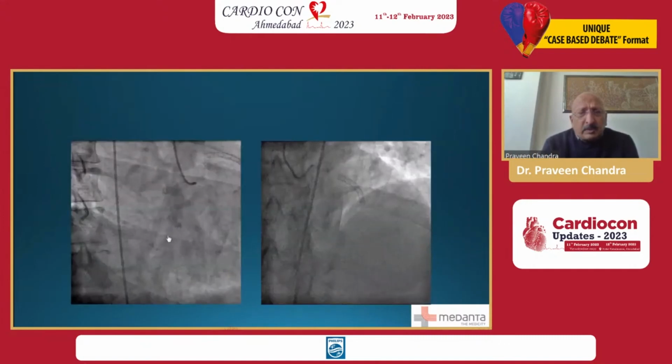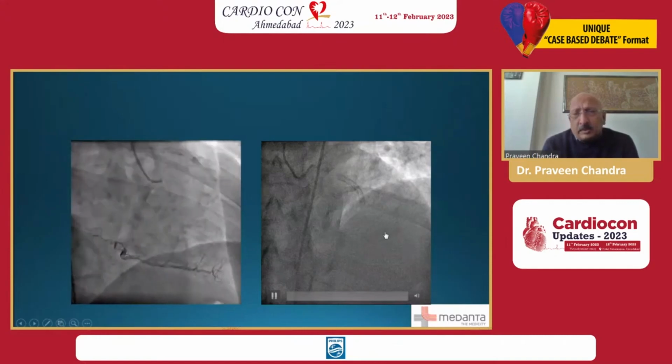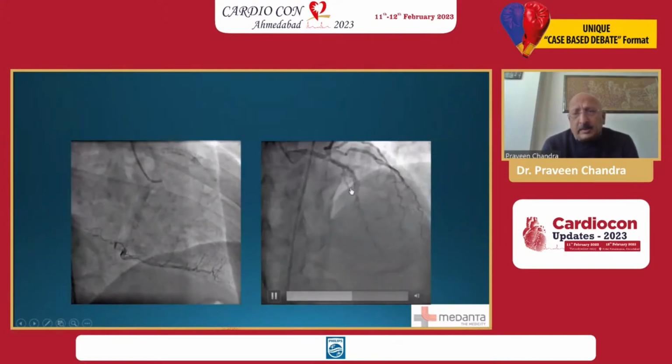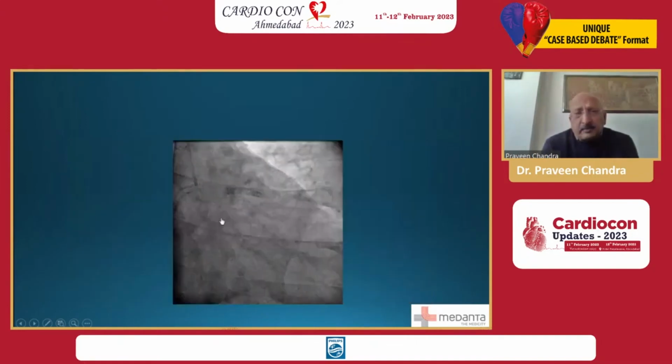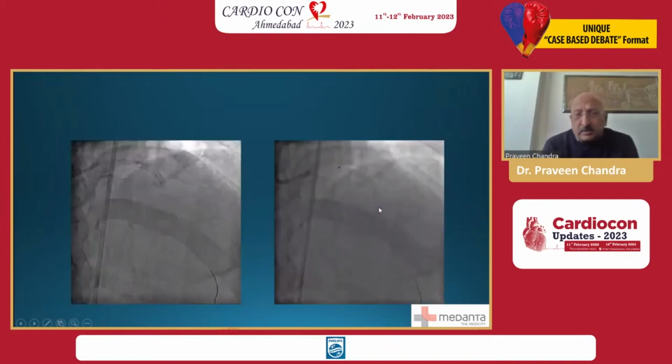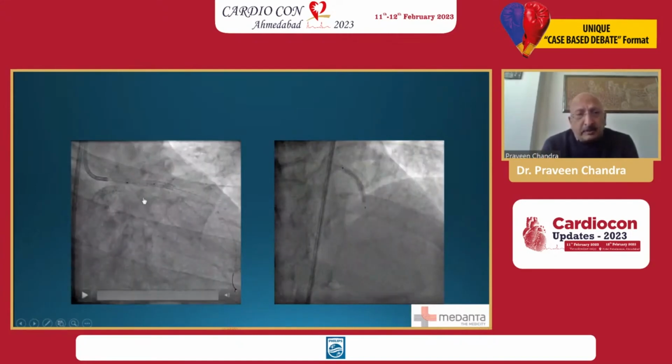This is a patient where the initial angiogram showed the RCA was non-critical, and the LAD showed tight stenosis here, and at the distal end there was a thrombus which we detected with the help of imaging. This patient had a creatinine of 1.4 or something, and we didn't want to increase any contrast injections, so we did it with the help of first the balloon dilator here, then doing a laser followed by OCT using a saline contrast, and then followed by a cutting balloon at the proximal end, and all this was done through imaging, and then followed by drug eluting.